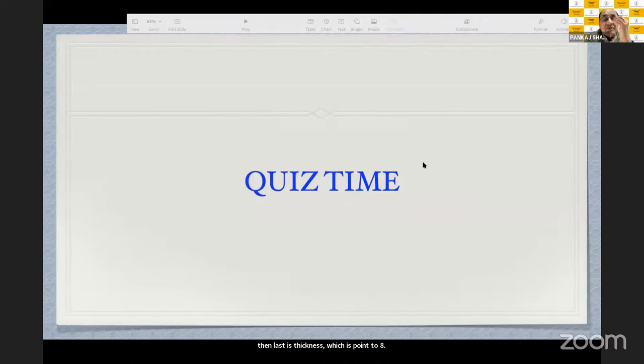Then there are aspheric neutral IOLs also, in which the spherical aberration is zero. That means the central and peripheral powers are equal. So aspherically neutral IOLs are made by Bausch and Lomb. Now, the use of aspheric neutral IOLs is post-refractive surgery, when you don't know the spherical aberration, or you don't have a topograph to know the exact sphericity of the cornea. About 80% of corneas are positively aspheric, but a very small number of corneas are by birth negatively aspheric also. Those corneas will do very badly with a negative aspheric IOL. So if you don't know, then you should usually implant an aspheric neutral in a post-refractive surgery.